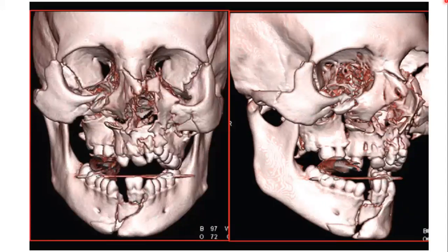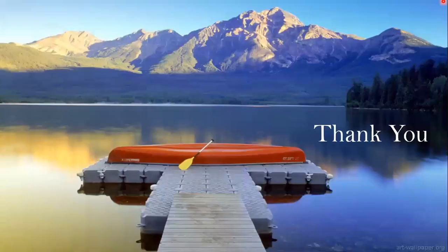This is a 3D scan of a patient with multiple facial fractures. Thank you. Have a nice time.